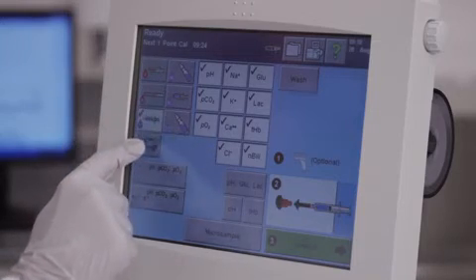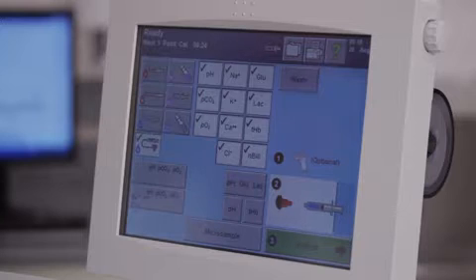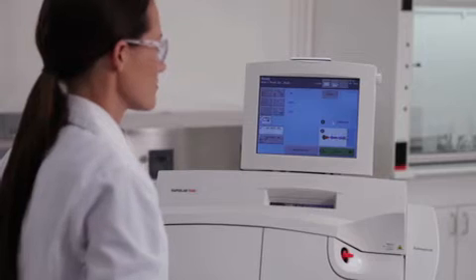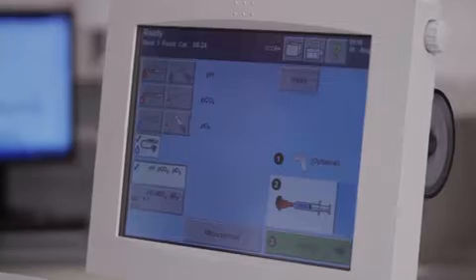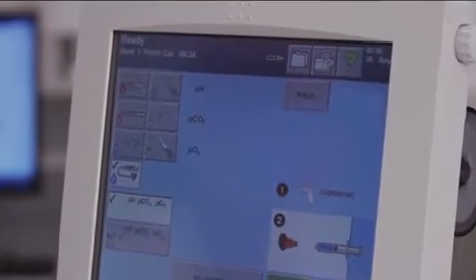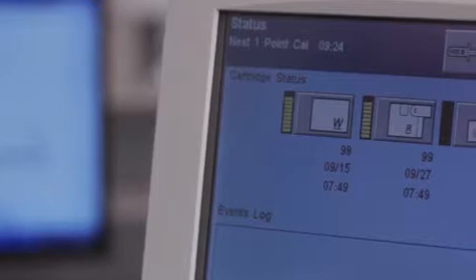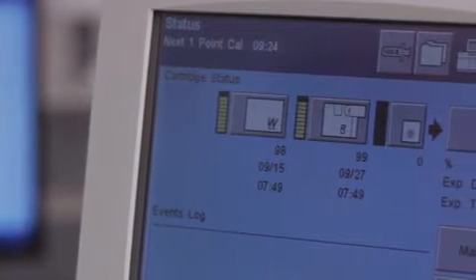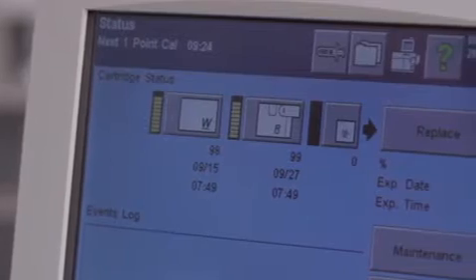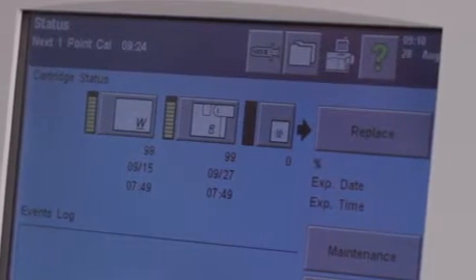To further speed workflow, commonly requested panels may be predefined and readily accessible from the main screen. The banner at the top of the main screen indicates the time to the next calibration, the type of calibration, the percentage of reagent remaining in the cartridge, and other various routine functions.